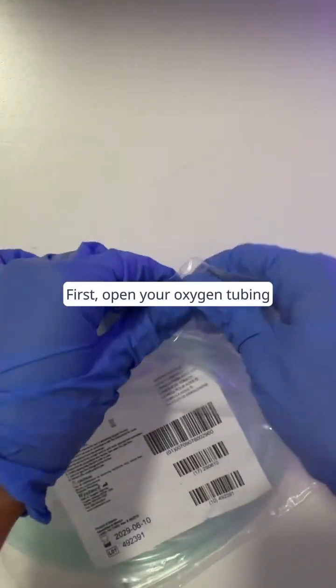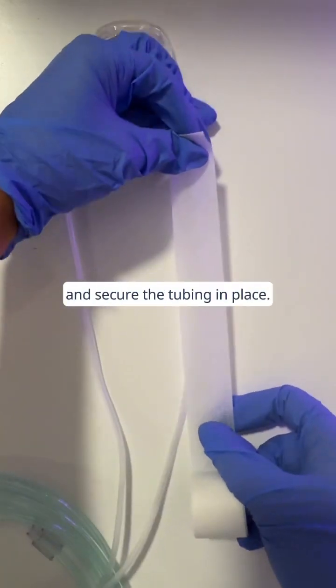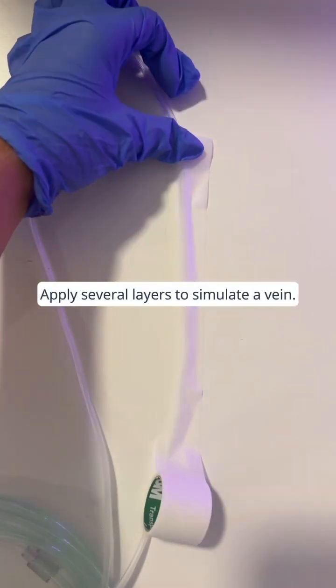First, open your oxygen tubing and lay it flat on the surface. Then grab your tape and secure the tubing in place. Apply several layers to simulate a vein.